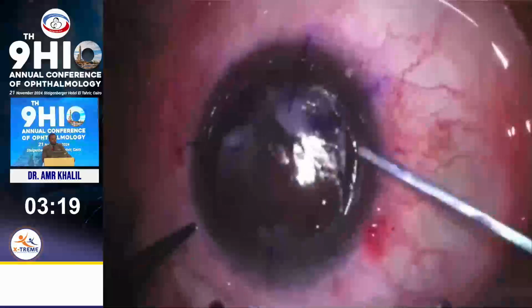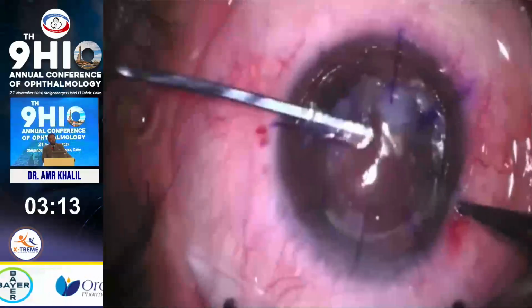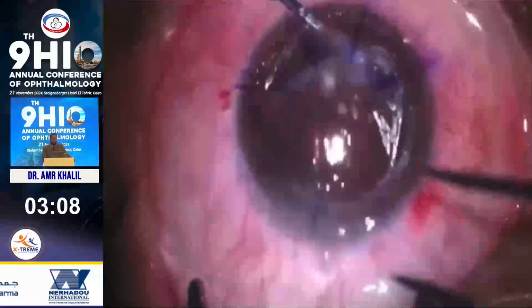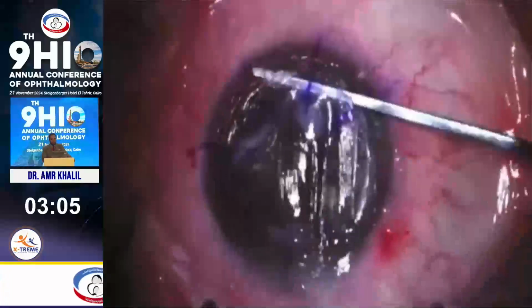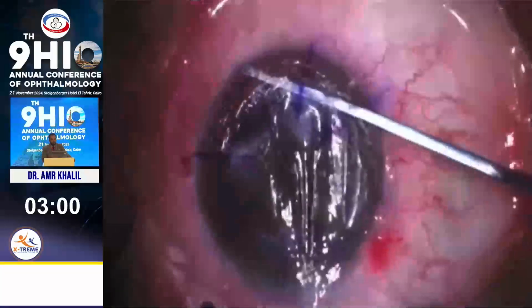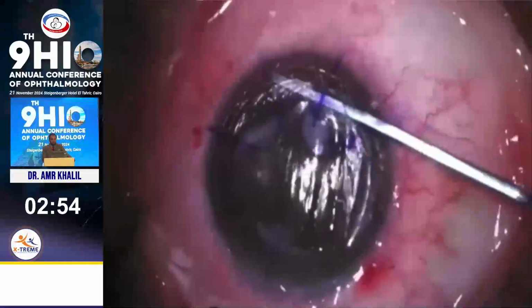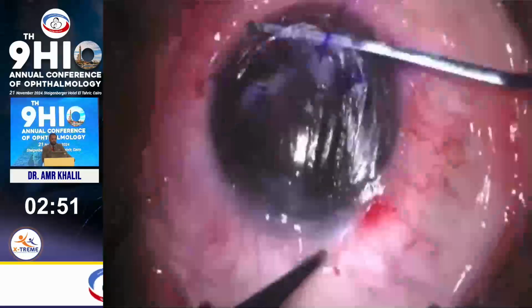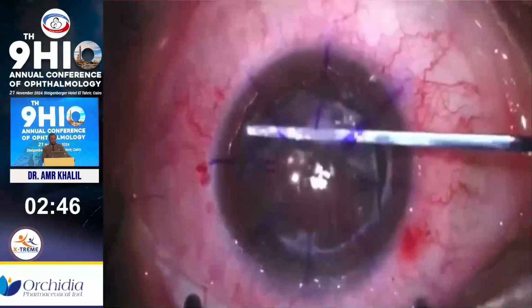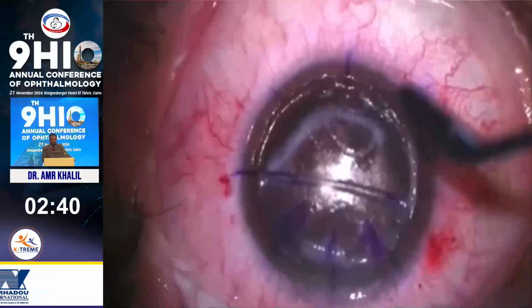If you lift the spatula up toward the flap, it's easy to make a hole, which, needless to say, is undesirable. You can go through with the spatula from the other side or from one side. Here is an area of macrostria, which will be dealt with later in this video. Again, take your time in this crucial step. Once the flap is mobilized, I was able to elevate the flap and deal with the interface.